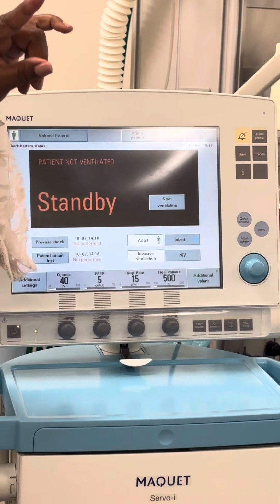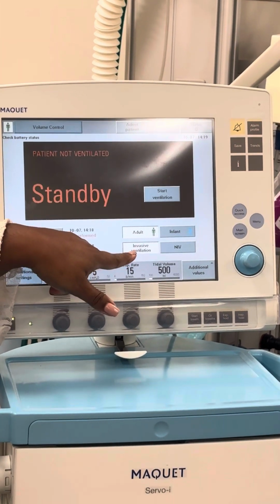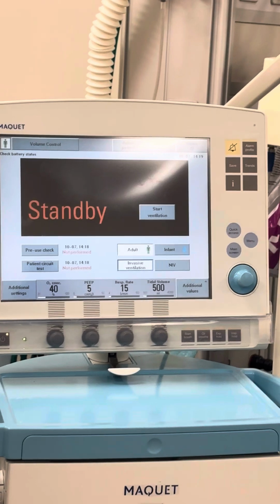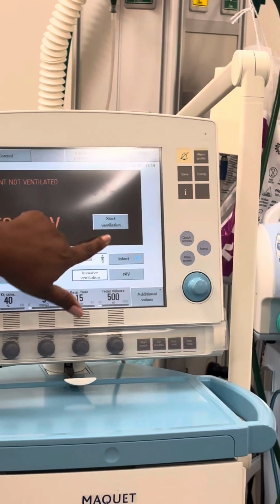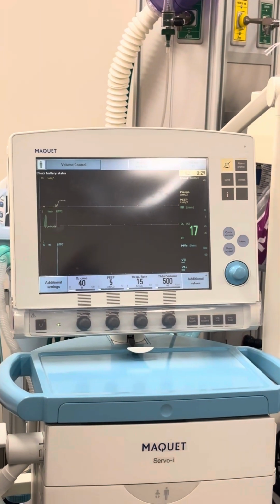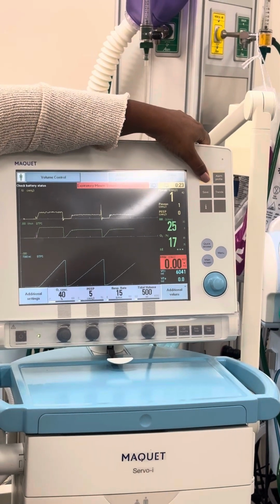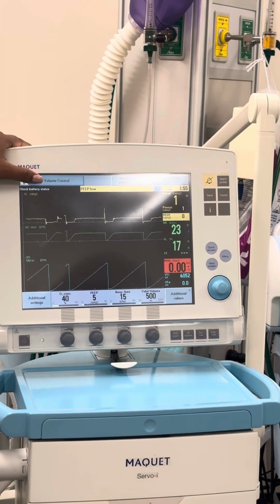I think you had adult over here with the heights and all that. So you have adult or infant, and then you have invasive or non-invasive. So we're going to do adult and invasive, right? That's really the only kind of check here. Not that difficult. So then we're going to actually do start ventilation. Once we hit start ventilation, we're going to start at the very top. I'm going to go ahead and hit this again. So we're going to start with volume control.